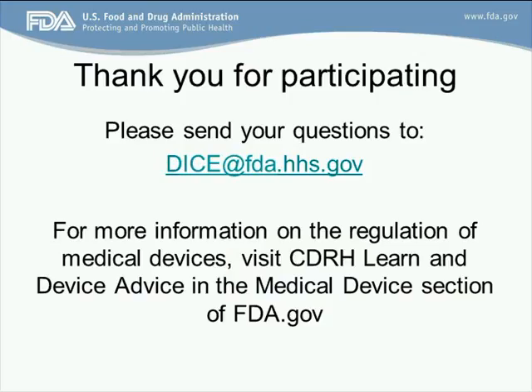Jeff, did you want to comment on that? Yeah, I had it on mute. I'm thinking about it. I understand the question, and I agree that usually equipment in the hospital has a protective earth, but it doesn't have to be. You can have equipment in the hospital with just double insulation and two prongs also. So you can use the same equipment in the hospital and then transfer to the home. Thank you.